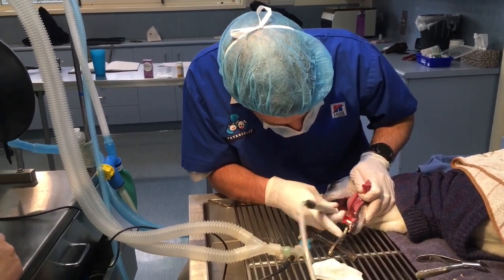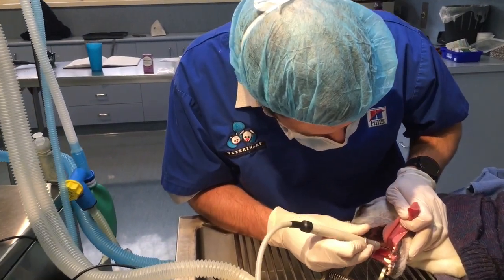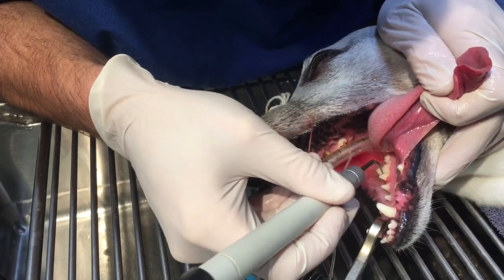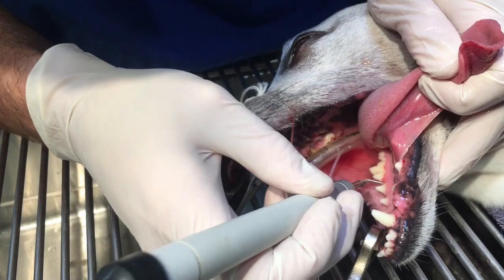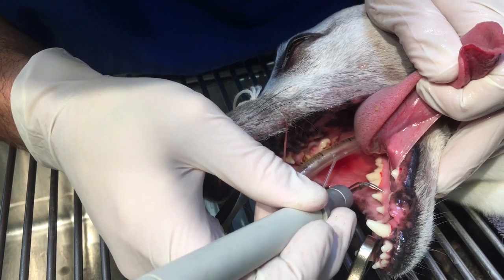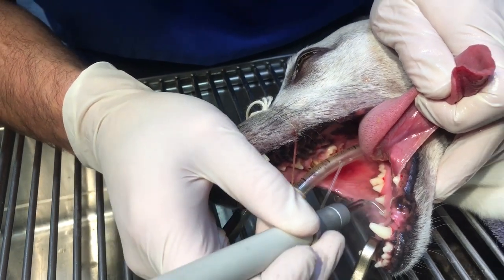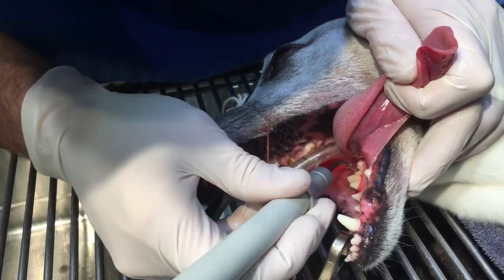There's a second little molar up here — sometimes a little bit cheeky, pardon the pun given that it hides up in the cheek. This little bit of gingival bleeding is fine — that'll settle down no problemo. Get up in there, clean all in there, check the inside of the molar. Her heart rate's gone up so maybe pop her up a little bit. I'm going to come in here and get some of the insides of the bottom teeth. This is always the hardest bits of the teeth to get to when they're awake — you just can't see in here, you've got tongues, and dogs generally don't like you going to the inside of their teeth.